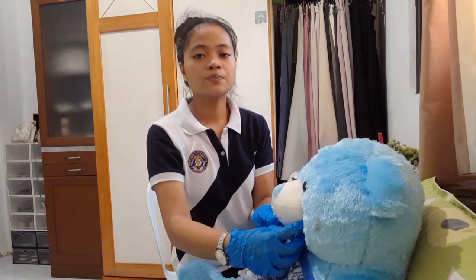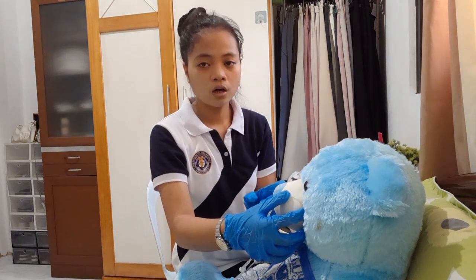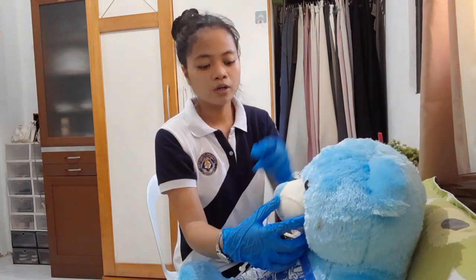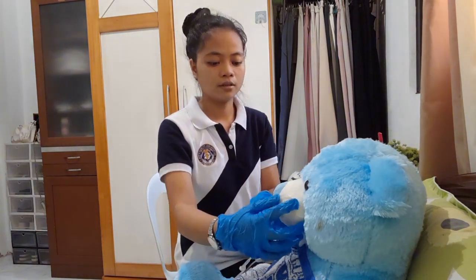Then if the patient begins to cough or turn cyanotic, we're going to withdraw the tube immediately. Then after that, if obstruction is felt, we're going to pull out the tube and try the other nostril.